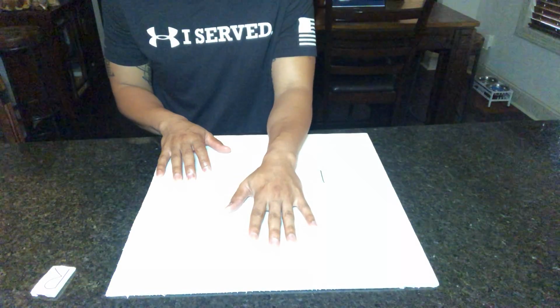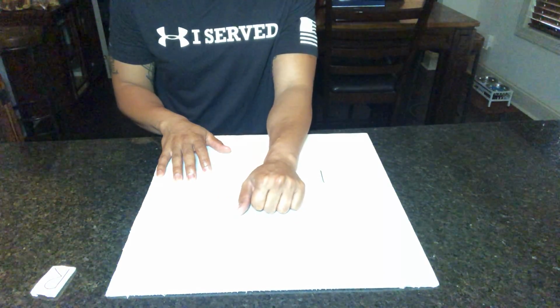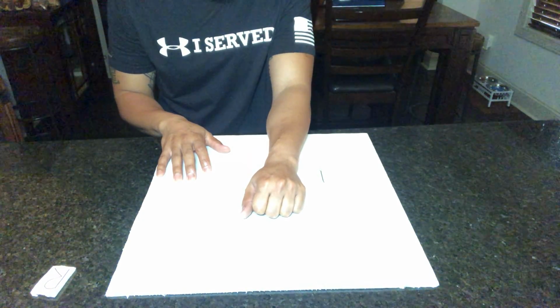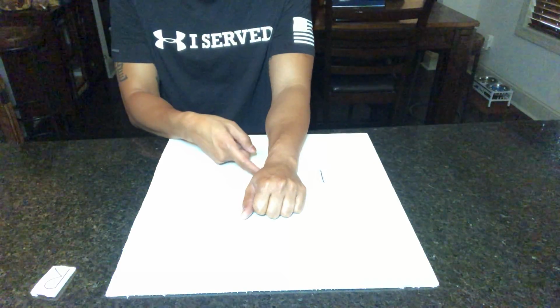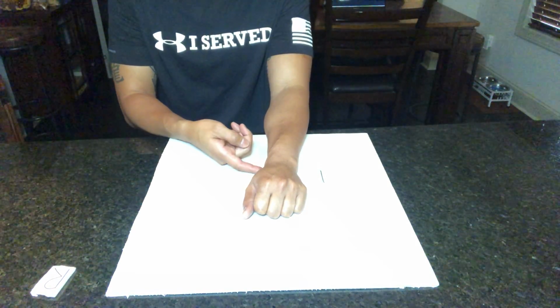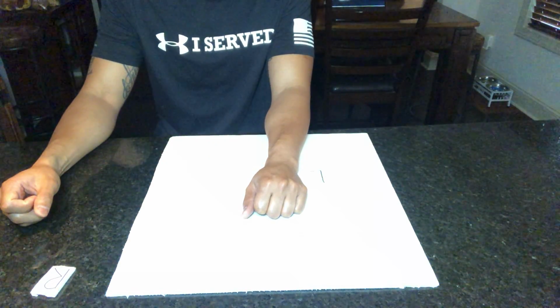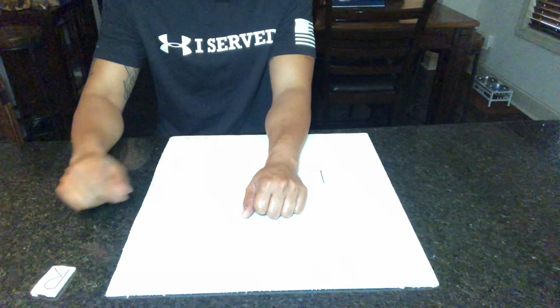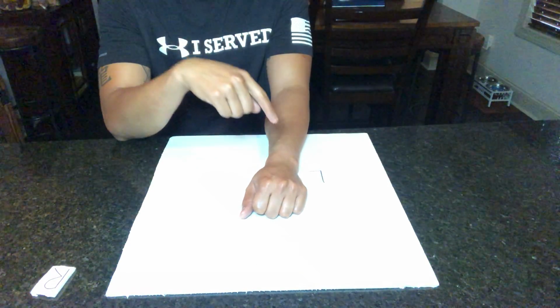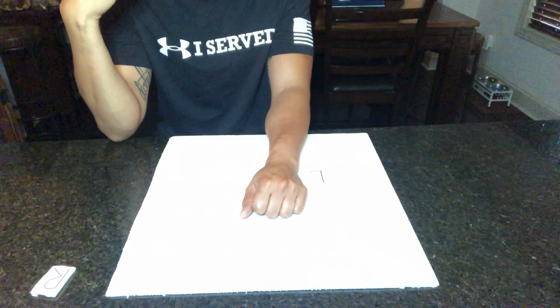In this case, we're going to have the patient lay their hands flat, and we're going to have them roll their fingers into a fist, or at least roll the fingers underneath here. It's going to reduce the amount of space here and get the wrist to lay as flat as possible on the cassette. So with the PA wrist, SID again is 40. We're using a 10 by 12 cassette.